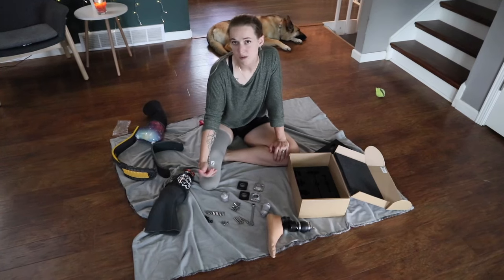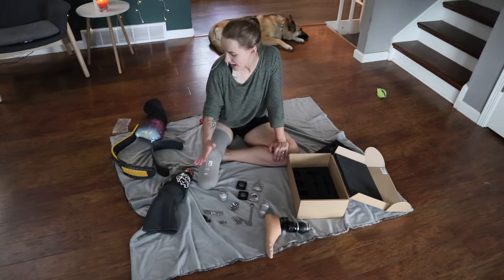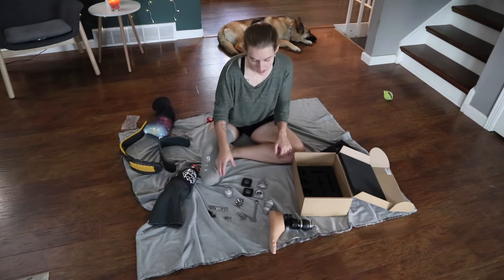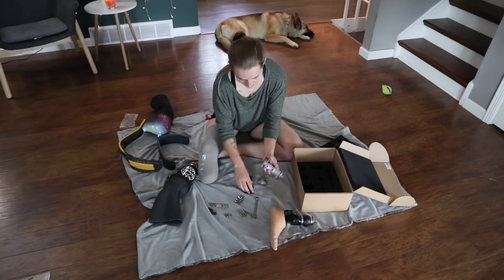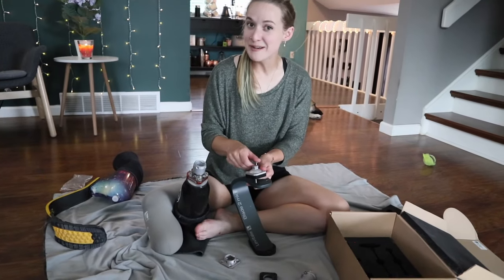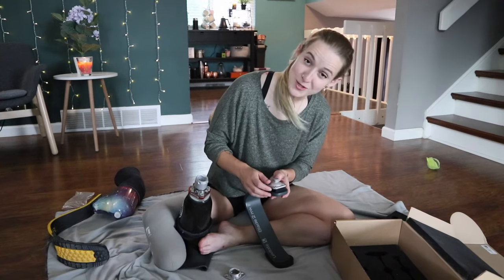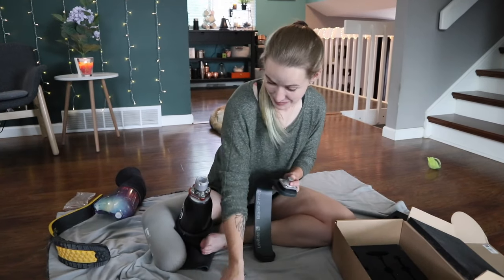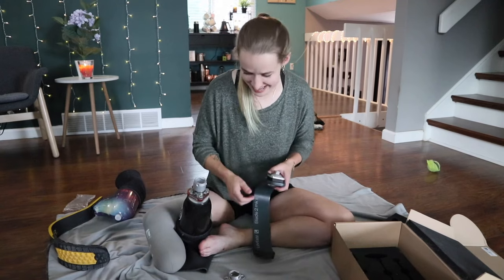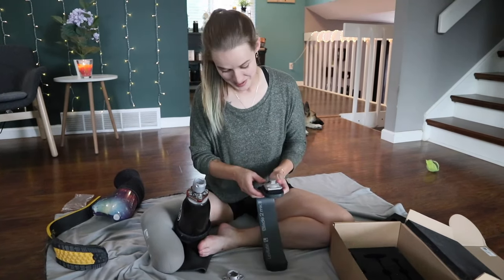Everyone has different lengths with their amputation. Mine's about six inches below my knee, and because I'm not a super tall person, I'm not going to need a lot of extra height. This comes with a ton of pieces where you can extend it up really high. I actually think I am like the model person to try this out on my own, because a lot of other people are super handy with this kind of stuff and I am terrified of it — so if I can figure this out, I will feel extraordinarily confident in recommending it to other people.